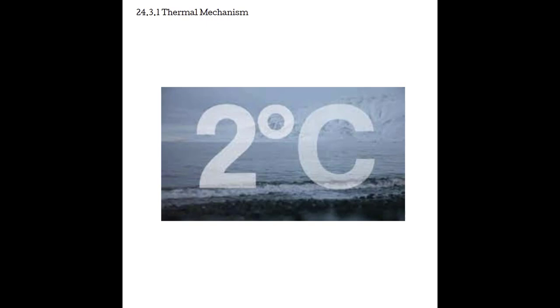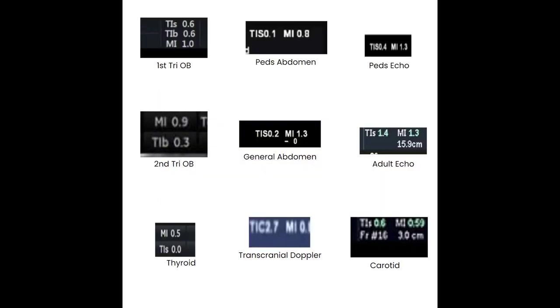For example, if the thermal index is indicated to be 1.0, then there is potential for an increase of 1 degree during the exam. If the thermal index is at 2.0, the exam is at the maximum recommended thermal indice and the exposure time should be limited. Here I have a bunch of examples from different presets and different exams showing the thermal indices indicated by the machine.